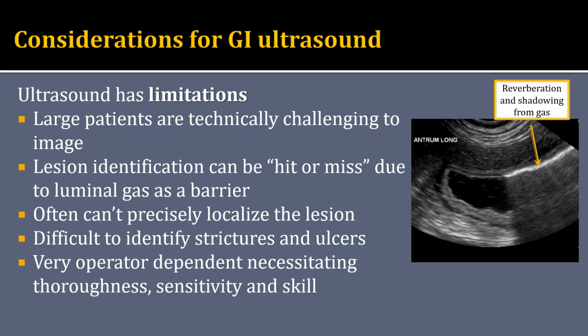Unfortunately, ultrasound does have limitations as well. Large patients can be quite technically challenging to image, especially if they are gassy. And in large patients, we may actually want to consider doing a CT or an MRI so that we can see the entirety of the GI tract and the regional tissues.